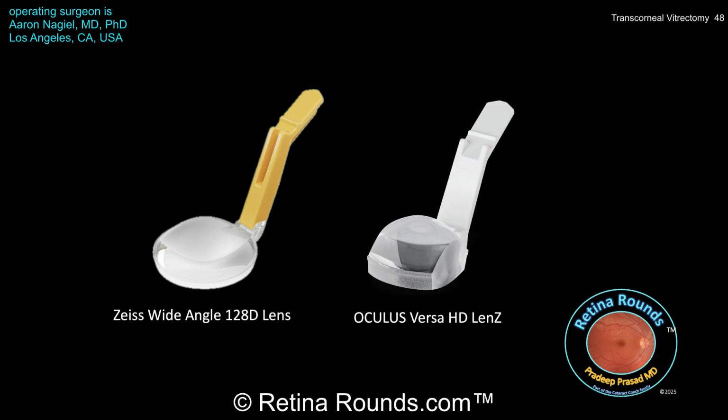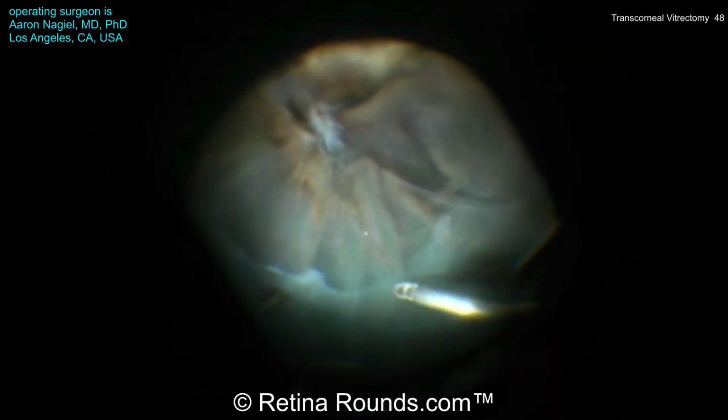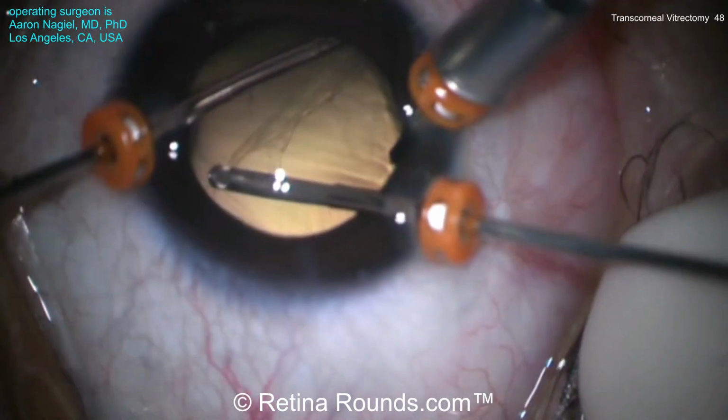Now, the wide angle viewing is limited to the axis of the lens itself, and so to gain wide angle viewing in different quadrants or in different clock hours, the lens does need to be rotated. But this particular lens does allow for a more vertical approach. So going back to the vitrectomy, this is going to be a pretty standard approach. A posterior vitreous detachment has been induced and the peripheral vitreous is shaved back.